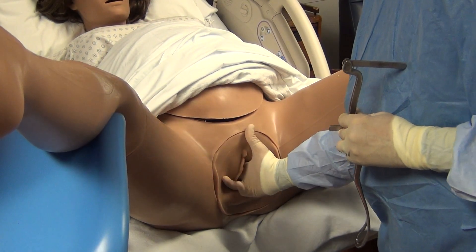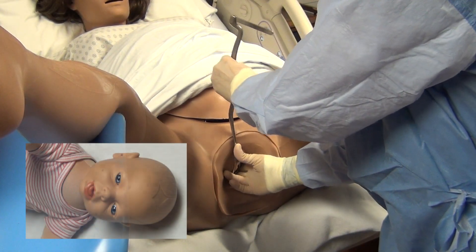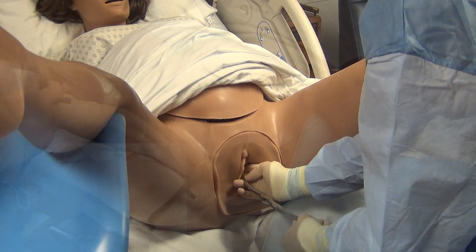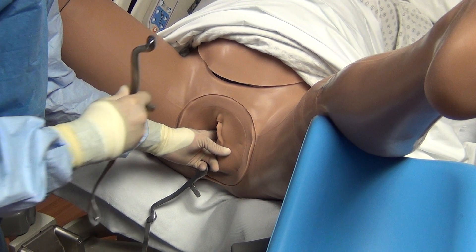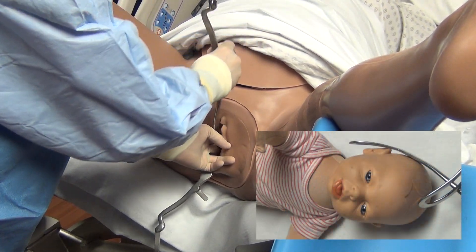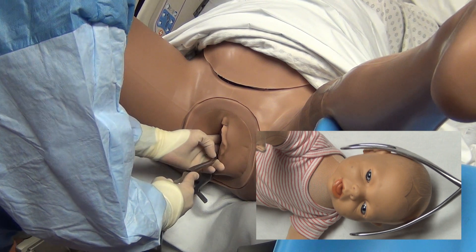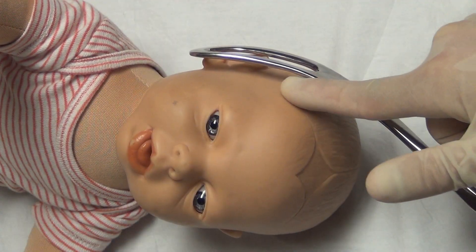Similar to the crossed forceps of Simpson or Elliott, the left forceps are easily placed within the pelvis and then wandered into position around the fetal head. The smaller blades make placement and wandering very simple. Proper placement is confirmed by palpating the edge of the blades in relationship to the anterior fontanelle and coronal suture lines.